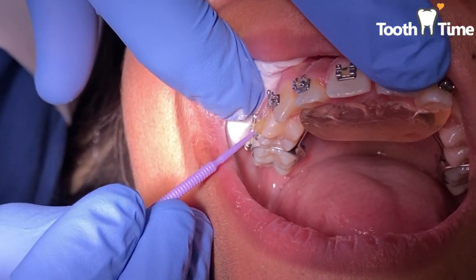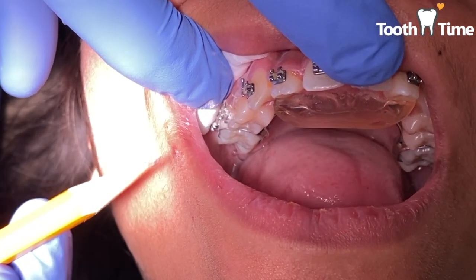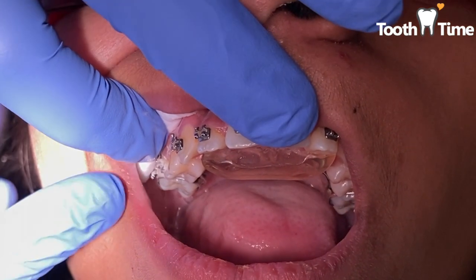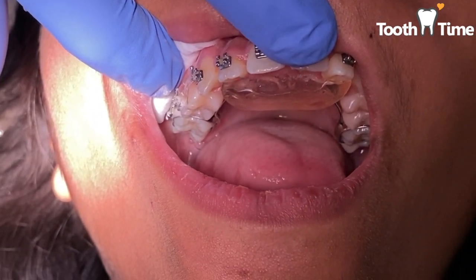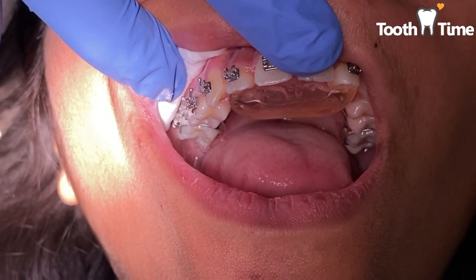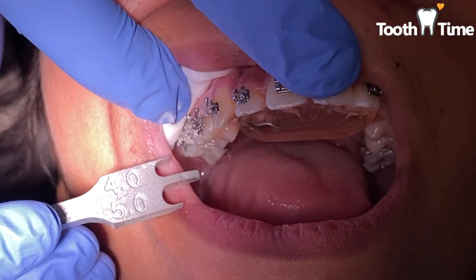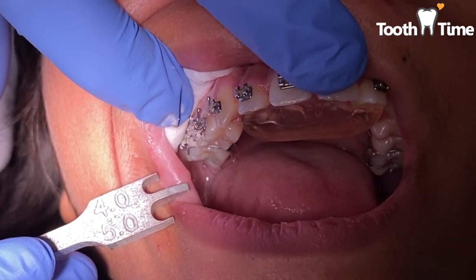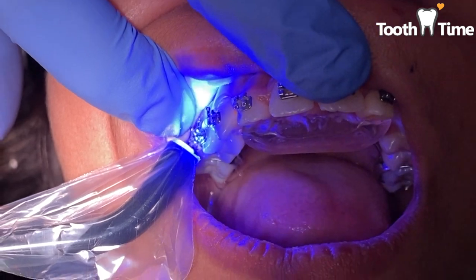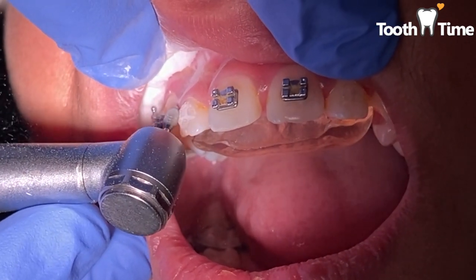We will apply some bonding material. We will then mark the tooth for bracket placement and then apply the bracket to the tooth as we measure as well. And of course, final step, you use your curing light to cure the glue. We will follow these steps with the next several brackets that need to be repositioned.